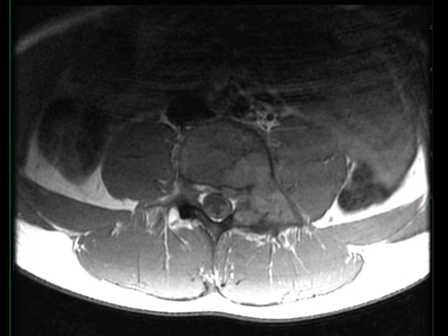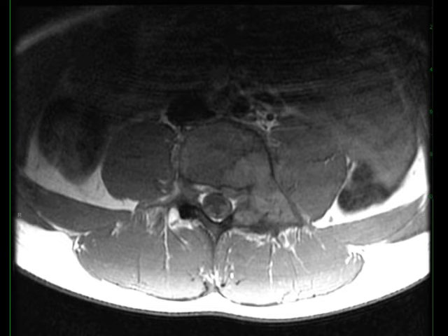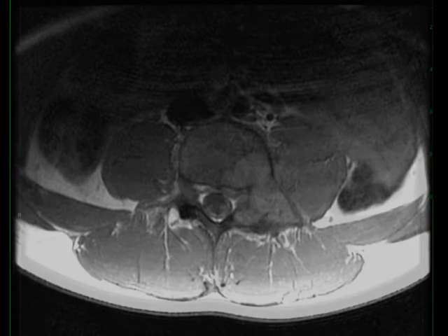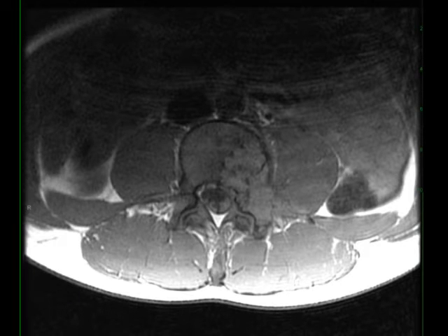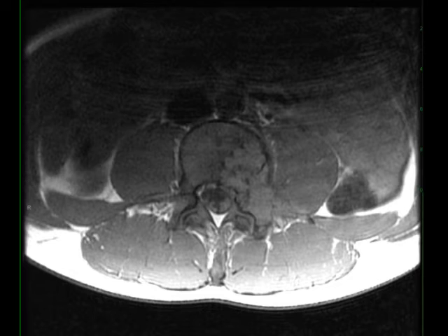This is a 12-year-old male with left lower back pain. The images demonstrate an expansile T1 iso-intense mass centered on the left pedicle of vertebra L4. There is iso-intense soft tissue which extends into the epidural space in the left paracentral, subarticular, and foraminal zones.